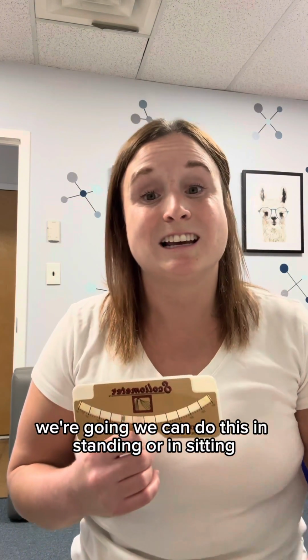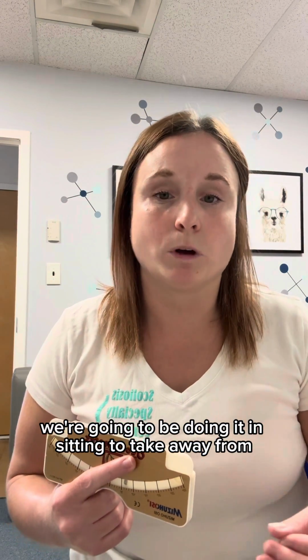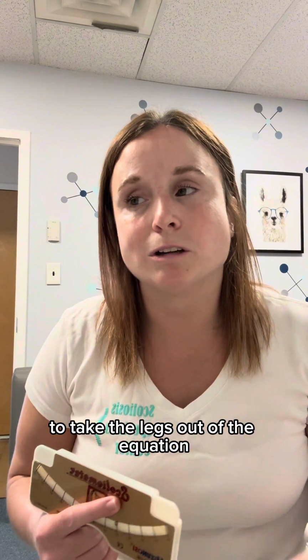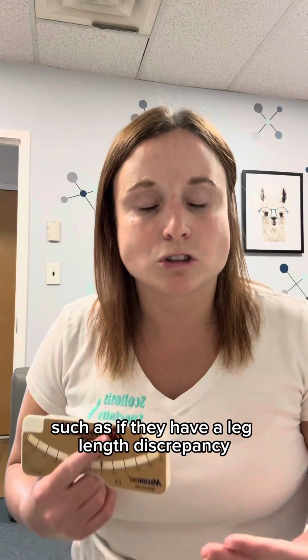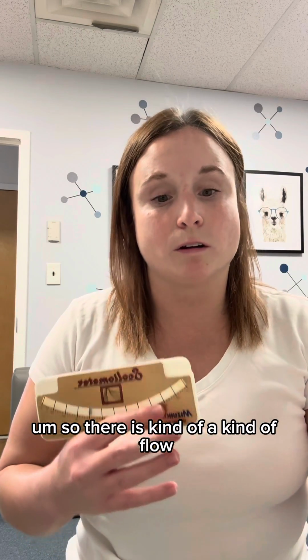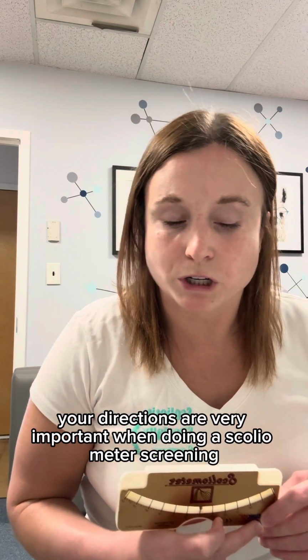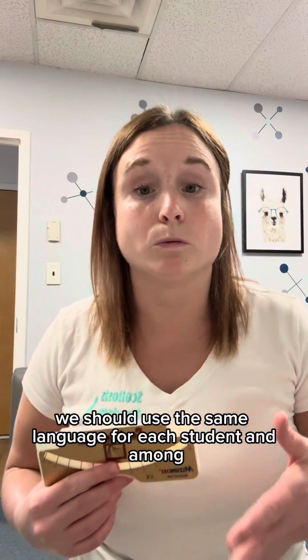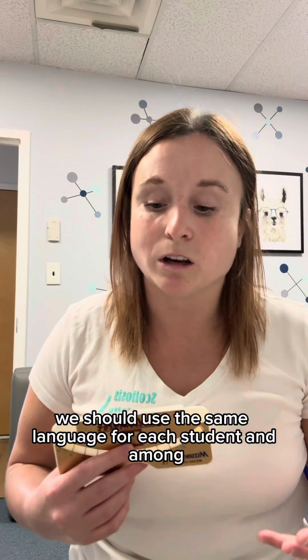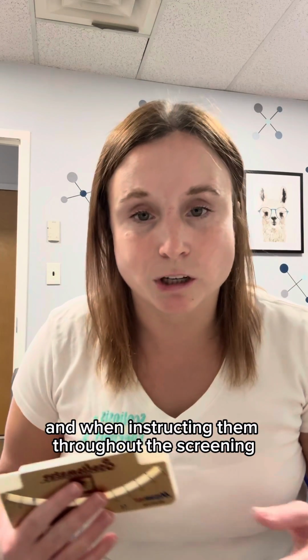We can do this in standing or in sitting. During the school measurements, we're going to be doing it in sitting to take the legs out of the equation, such as if they have a leg length discrepancy, that won't be seen in the scoliometer measurement when they're sitting. So there is a flow. Your directions are very important when doing the scoliometer screening. So we use the same language for each student, and each therapist should have the same language when instructing them throughout the screening.